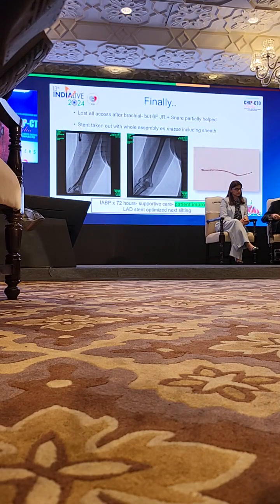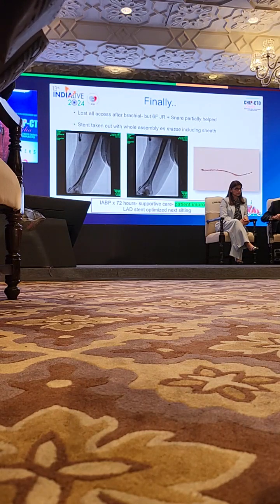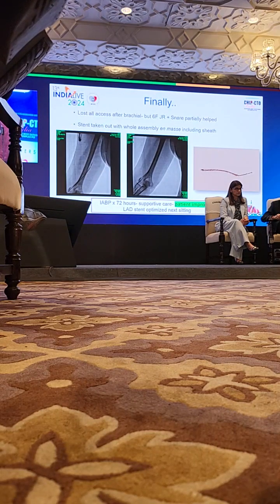Now back to this stent that is fractured. We tried to pull it back, but we lost balloon and wire access, and ultimately we took the EBU out. We exchanged it with a JR. We put a snare in, pulled it into the guide. It could only partially come in because the widest part would not come in. We pulled the whole complex out en masse with the sheath, and the stent came out in one piece, although unraveled. The patient was allowed to marinate with an IABP for 72 hours.